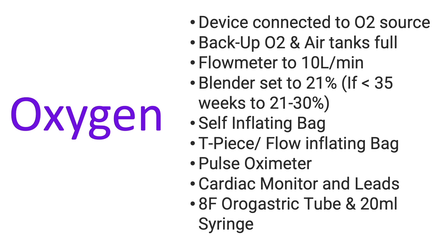Under oxygen, make sure that your resuscitator is plugged into the gas supply of your hospital. Make sure the backup oxygen tanks and air tanks are full. Set your flow meter at 10 liters per minute, and always remember when you set your flow rate, don't forget about your blender. Our blender should be set at 21%. If you're dealing with a baby below 35 weeks, you can consider the blender setting at 21 to 30%. We need to have a self-inflating bag available.